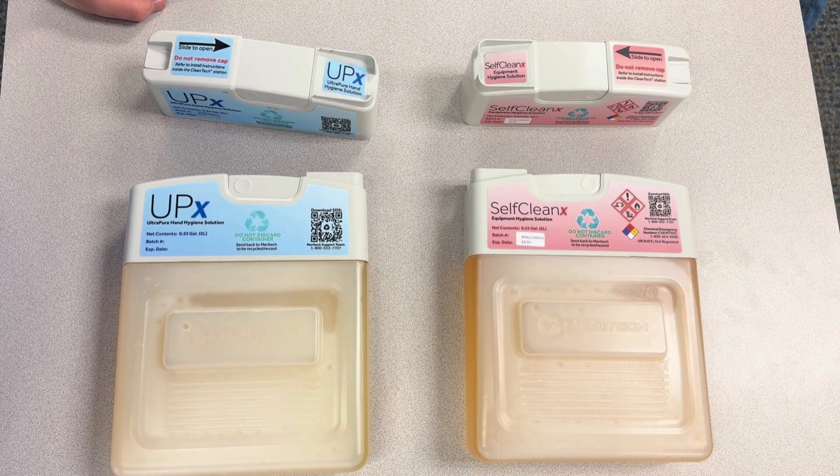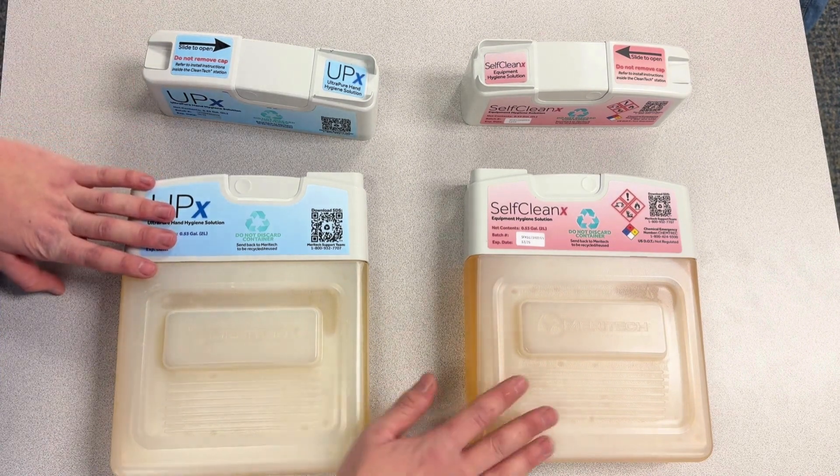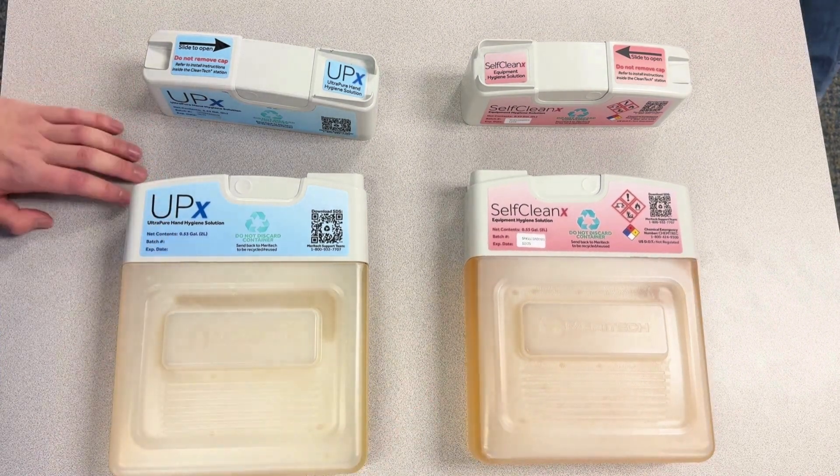Hi everyone, today I'm going to walk you through how to change a cartridge top on an Evo Solutions cartridge. As you can see here, we have a UP and a Self-X cartridge that both need their top replaced.